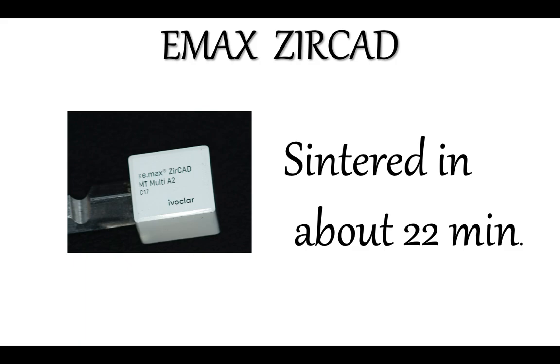And also, even though they are working on doing a lot more aesthetic zirconia, zirconia can be milled in thinner thickness, which is very good for those cases that you don't have enough occlusal space, occlusal clearance. And it's also good for those patients that are bruxers, but you are going to invest more time in milling, and the milling is not going to be in the regular way as the other ceramic.